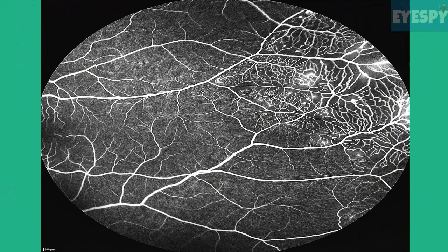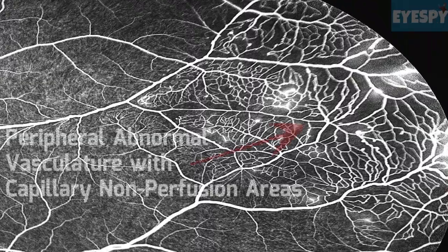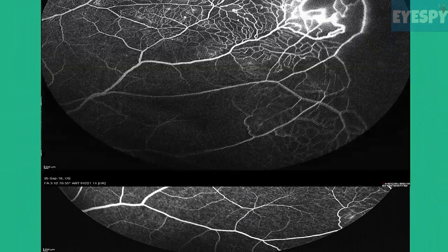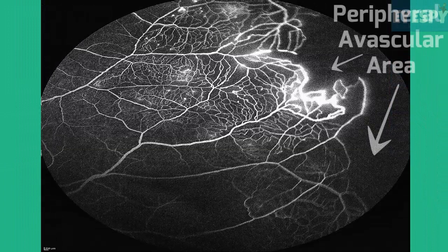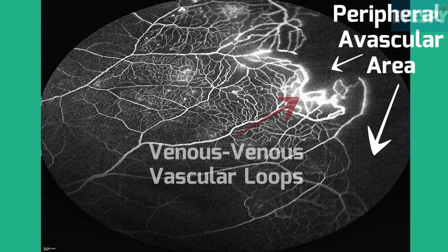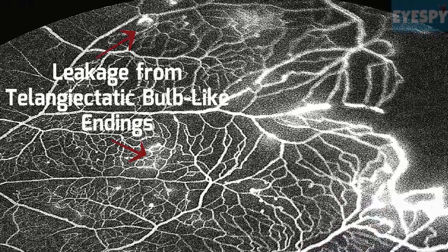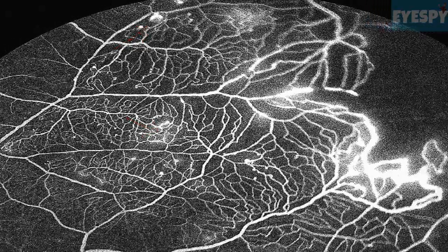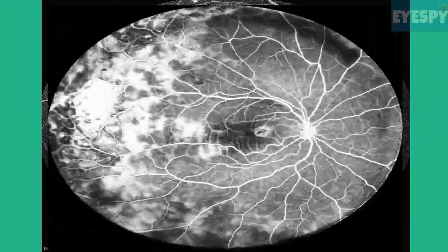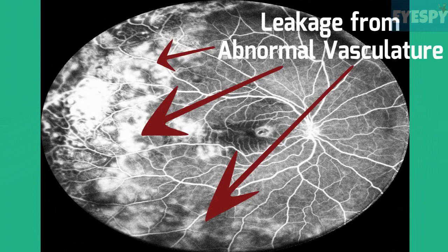The temporal periphery shows abnormal vasculature with capillary non-perfusion areas. An avascular area is very evident in the temporal periphery with staining of venous-venous vascular loops and some leakage of dye from telangiectatic bulb-like endings, while the right eye shows florid leakage from abnormal vasculature present mainly in the temporal quadrant and also in the superior and inferior quadrant.